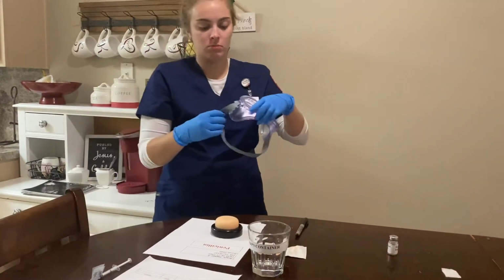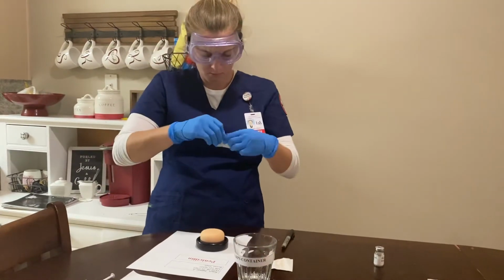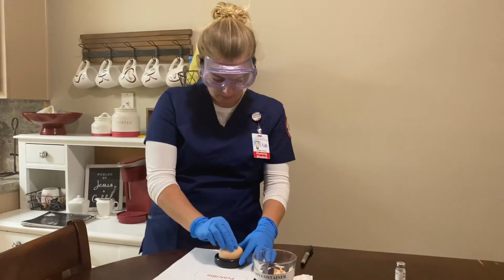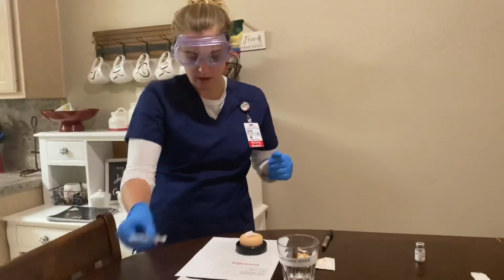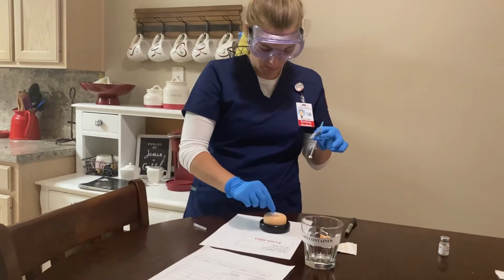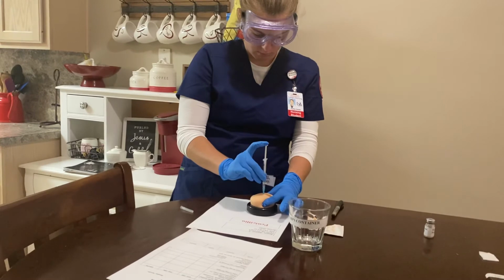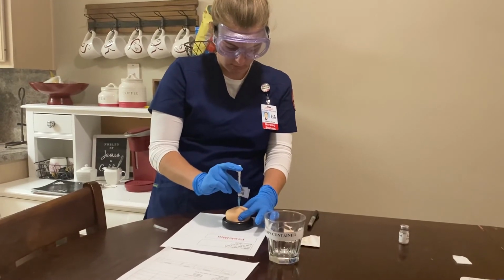And then my goggles. And then I would get the alcohol pad. And we will find the area first, so we're going to do it at the abdomen. Clean in a circular motion. And then I would get my syringe. And then we'll lift 2 inches at a 90-degree angle, and we'll do this slowly. And then we'll remove that.